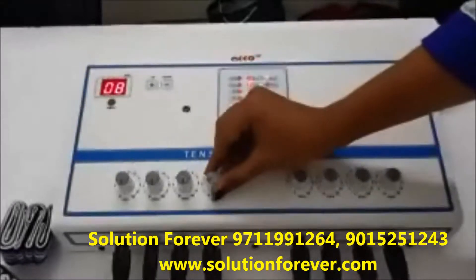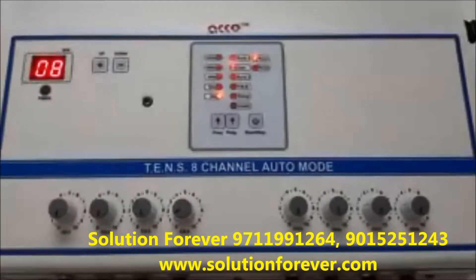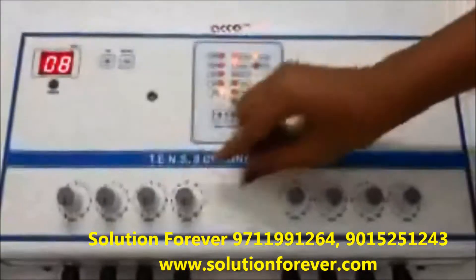if any of the intensity knobs are not at 0, the reset light will blink. Make sure all the intensity knobs are set to 0 before proceeding.